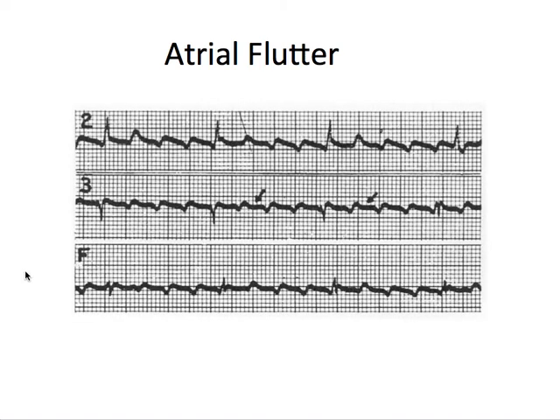Here's another one — this is more of an older EKG. We have our QRS complexes here. Let's count: starting at the QRS, 1, 2, 3, 4, 5 — we have five P waves per one QRS complex. So this is a 5-to-1 ratio. Our flutter waves are around 300 per minute, which is pretty typical for atrial flutter. Here's another one — this is uncommon, this is a 3-to-1, so for every 3 P wave beats, you will have one QRS complex.